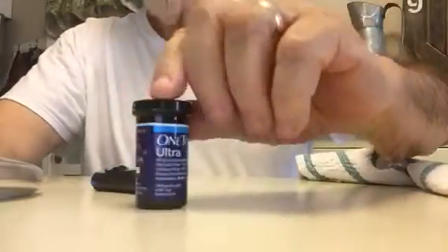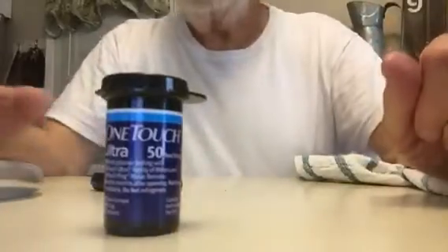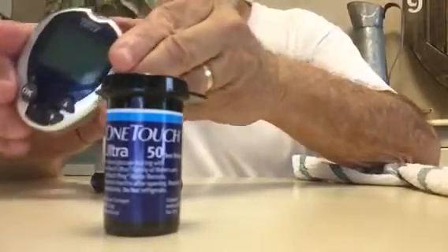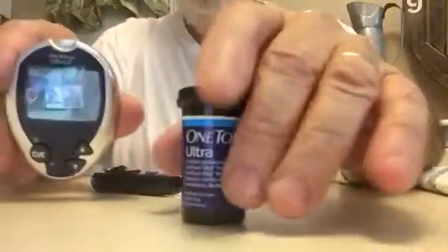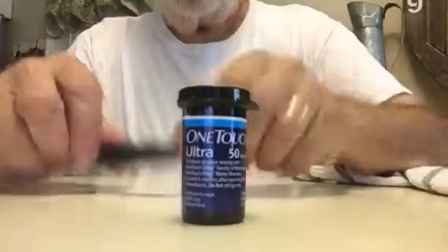I am ready to test my blood glucose. I'm using One Touch Ultra test strips and the One Touch Ultra 2 device, which seems to be pretty good.